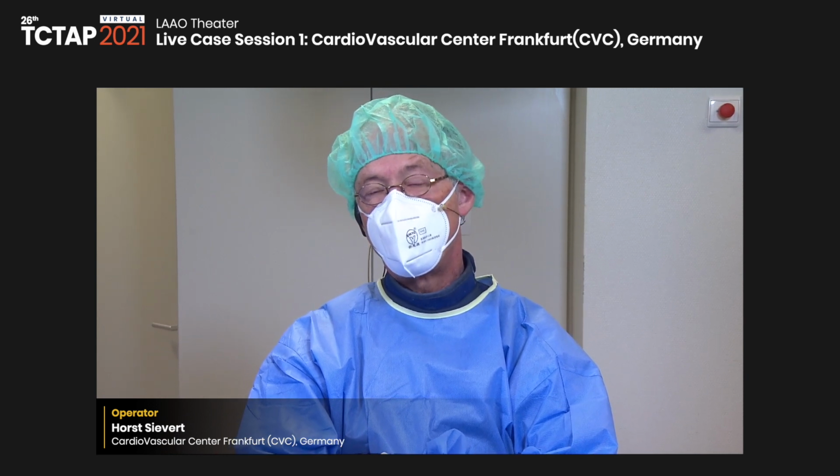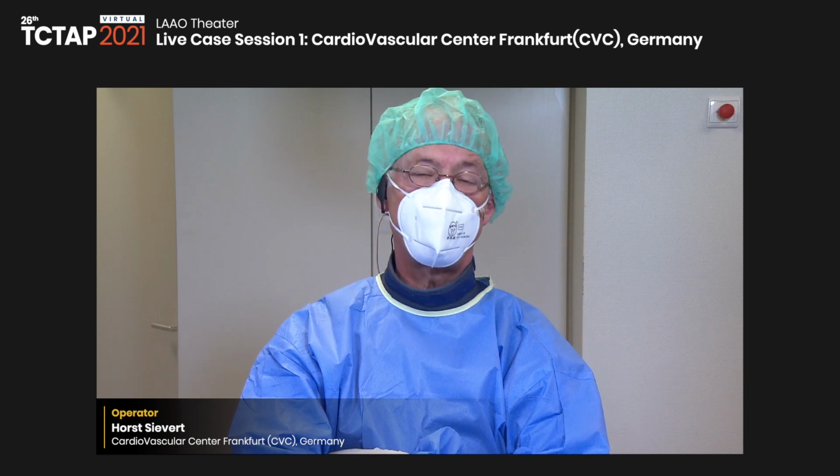Horst, do you follow patients up at 45 days, like in the previous Watchman studies with a TOE, if you have full closure? Yeah, we do our TEE since we started doing LAA closure before the PROTECT AF trial. We do our TEE after 4 weeks, but that's not a big difference whether you do it after 4 weeks or 6 weeks. So we do it after 4 weeks, and then we do another TEE after 6 months. And we do both of these TEEs not only to look for residual leak, but also for thrombus.